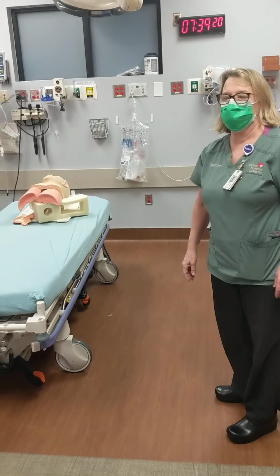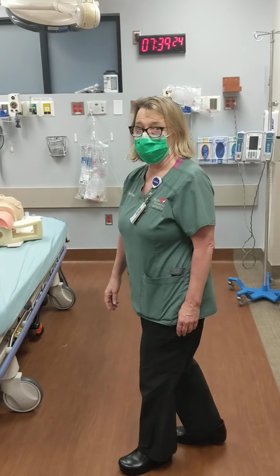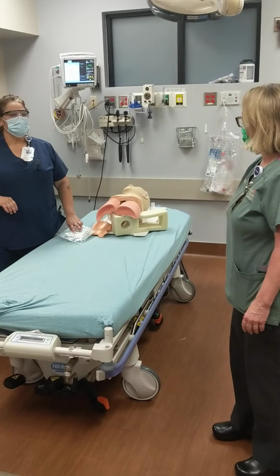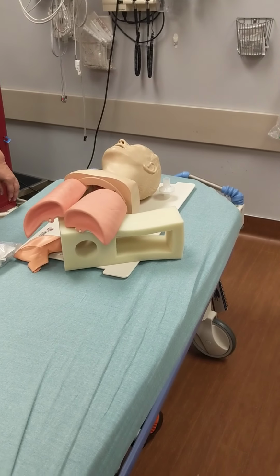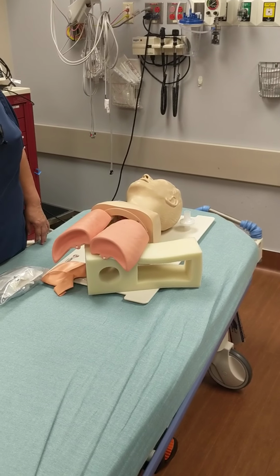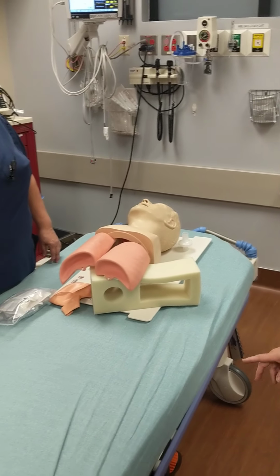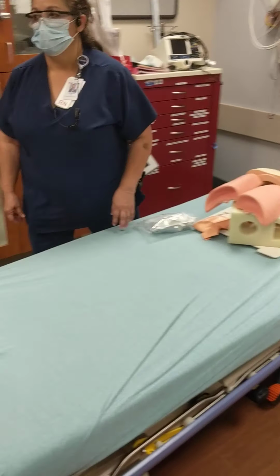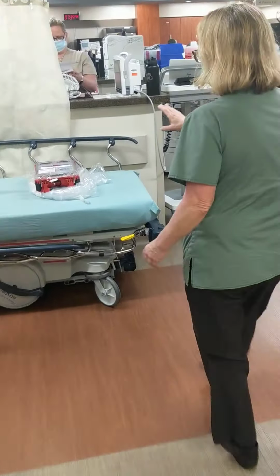Hi, we're going to show you how we are going to be intubating our patients throughout the house and in the ED. We're going to start with our patient, Ed, who's experiencing shortness of breath and hypoxia. For the sake of the video, he's on the monitor and our saturations are low. We decide to intubate.